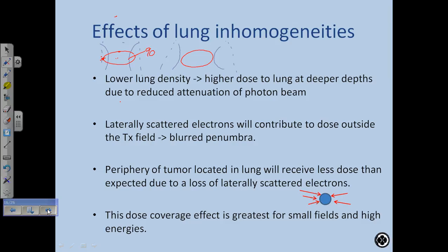And when you're doing a plan, you might not know the background of this patient. This patient might have already had radiation before. So the doctor now wants to deliver a lot more. He wants to be more aggressive. This could be a retreatment. You may not know that. So this is information that the doc would know that you don't know. So before starting a plan, it's always good to get as much background information as possible.